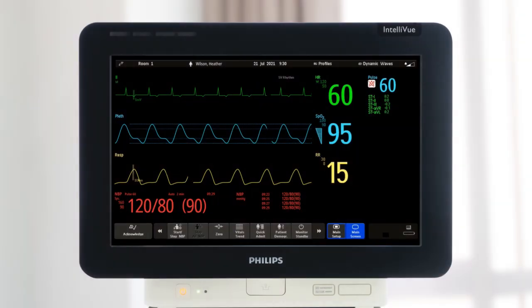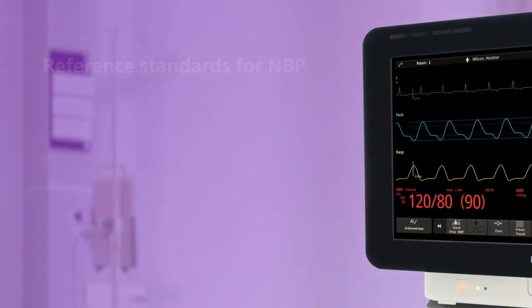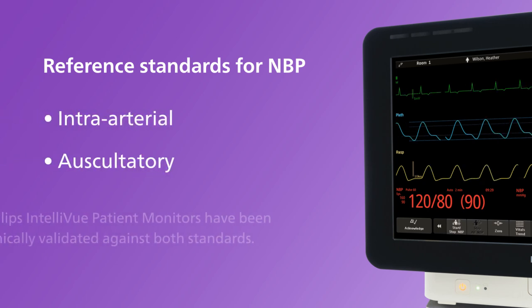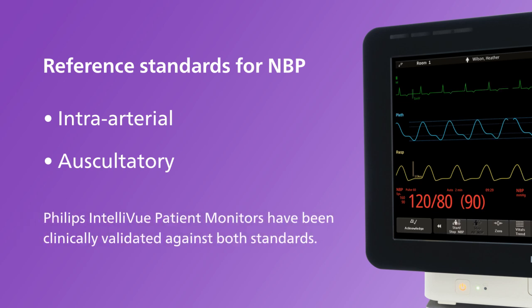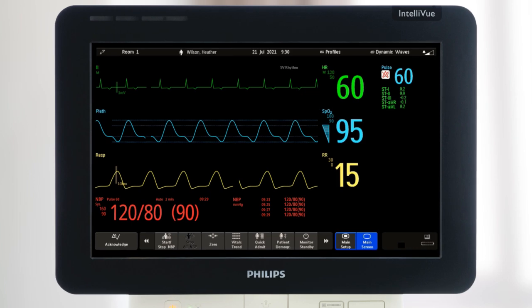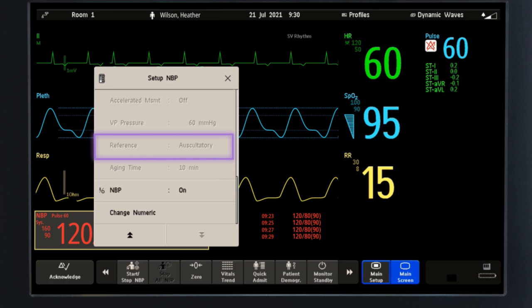Intelliview monitors use the oscillometric method for measuring non-invasive blood pressure, or NBP. There are two widely accepted reference standards used to validate the accuracy of NBP devices: intra-arterial and auscultatory. Philips Intelliview patient monitors have been clinically validated for adult and paediatric patients against both standards. The reference standard for neonatal patients is always intra-arterial. The reference standard can be viewed in adult and paediatric profiles in the setup NBP menu, but is pre-configured and cannot be adjusted.